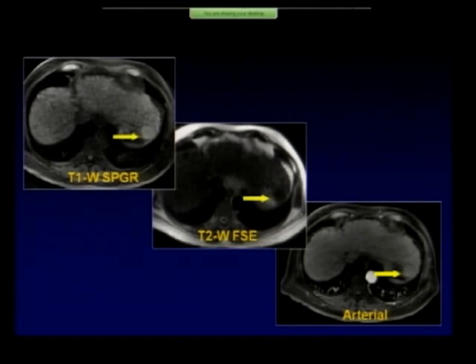And normally fibrosis is low signal intensity, as we know in the case of fibrosis anywhere in post-surgical areas or in fibroma or fibrothecoma of the ovary. But in liver, sometimes fibrosis can be high signal intensity on T2 weighted images. And the reason for that is because of active inflammation. This is hydrated fibrosis, an ongoing fibrotic process.